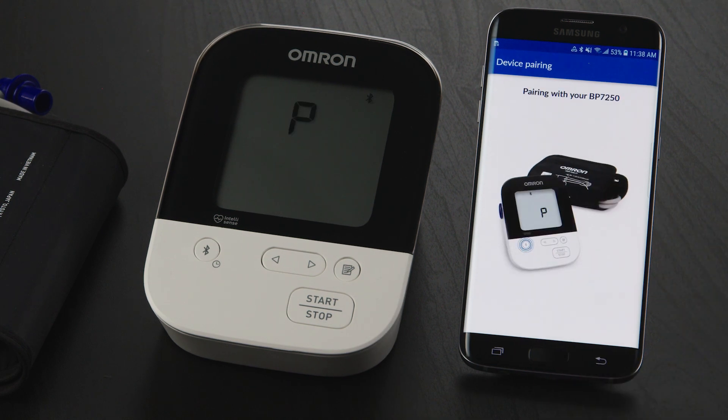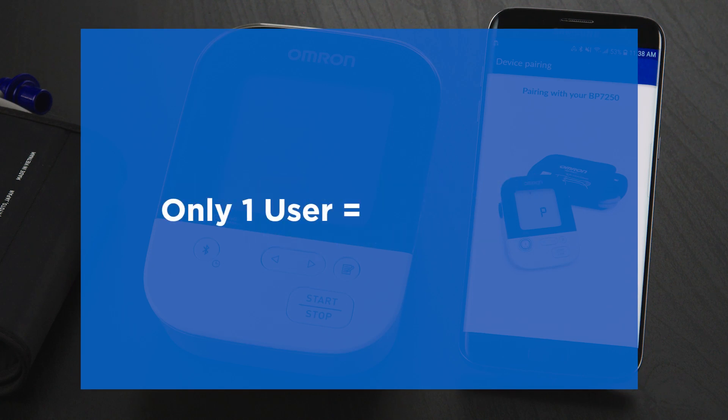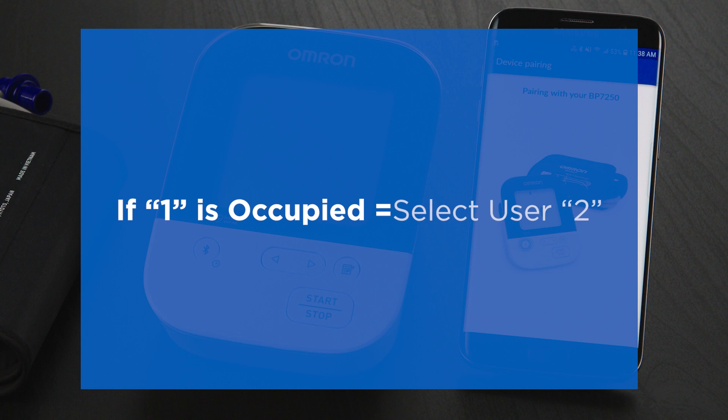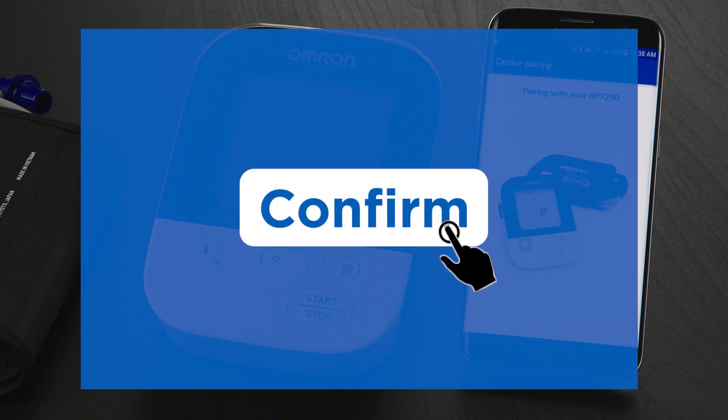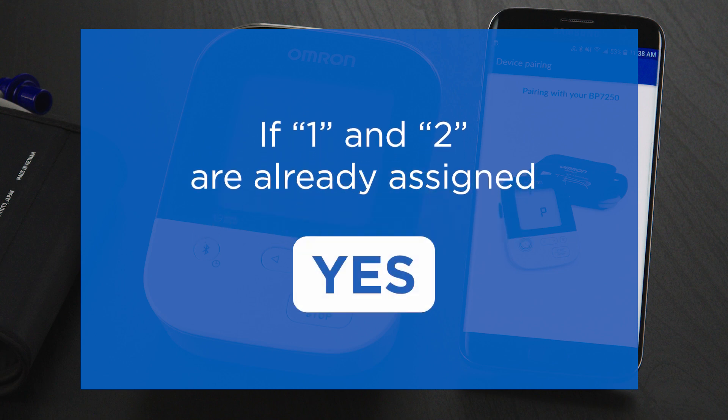You may see a pairing request — tap Pair. If your device allows two users, you'll be asked to select a user number. If you alone will be using the monitor, select User 1. If User 1 is already taken by another household member, select User 2. Once complete, tap the Confirm button. If both User 1 and 2 are already assigned on the device, you'll be asked to confirm your selection — tap Yes to confirm.